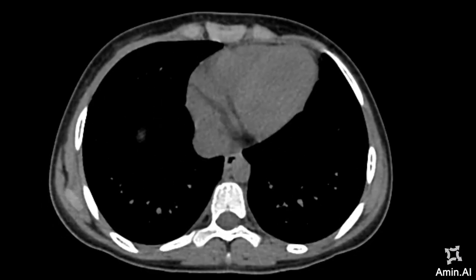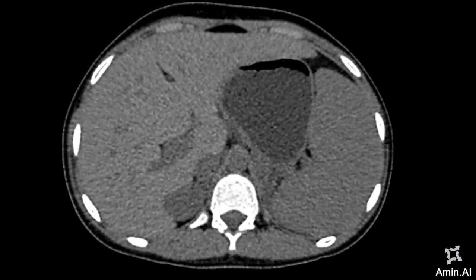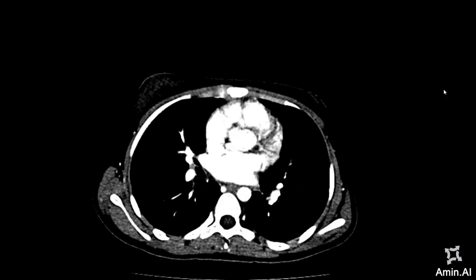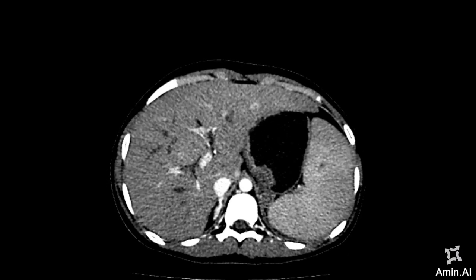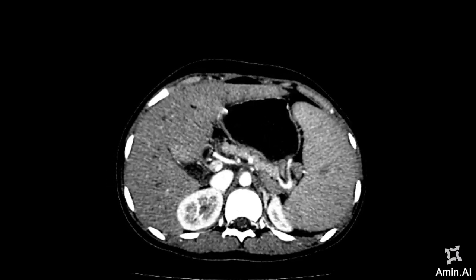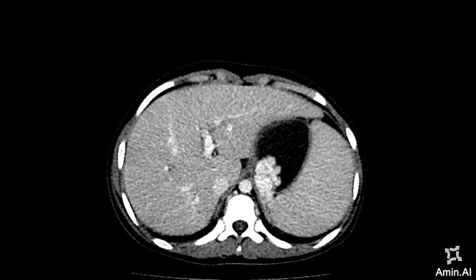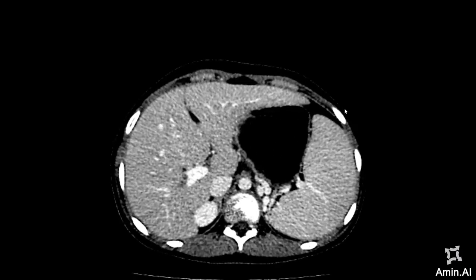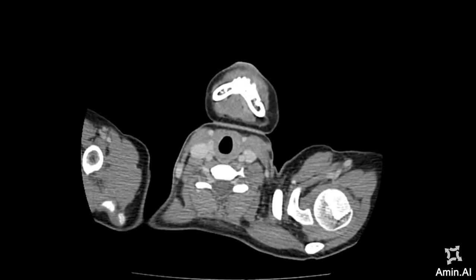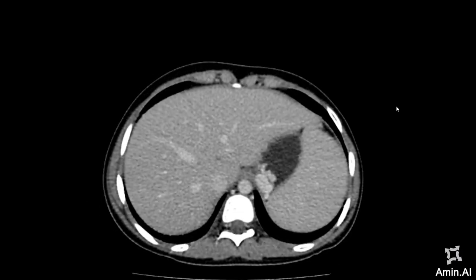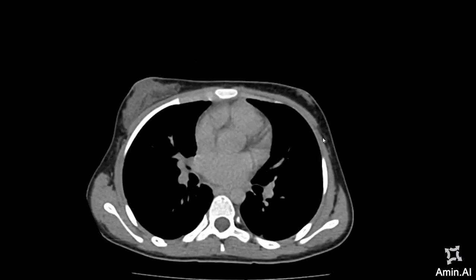These are the images. This is the non-contrast CT Abdomen, and I will be focusing towards the pathology. This is the arterial phase of the same patient, followed by the portal venous phase, the equilibrium phase images, and the delayed images.